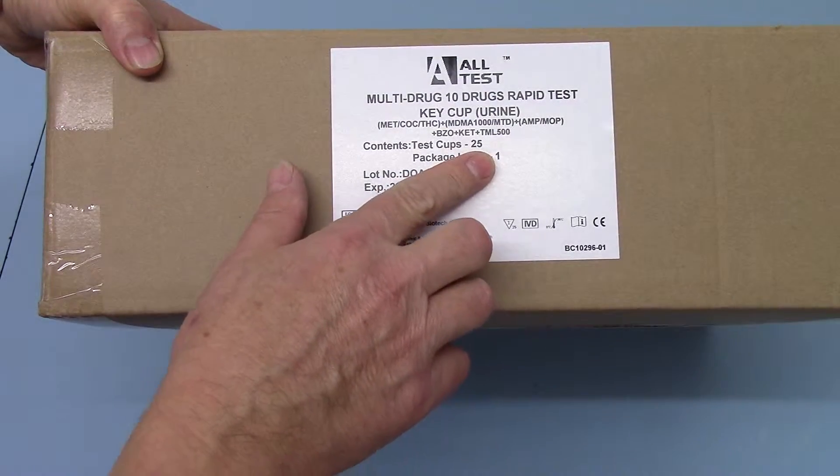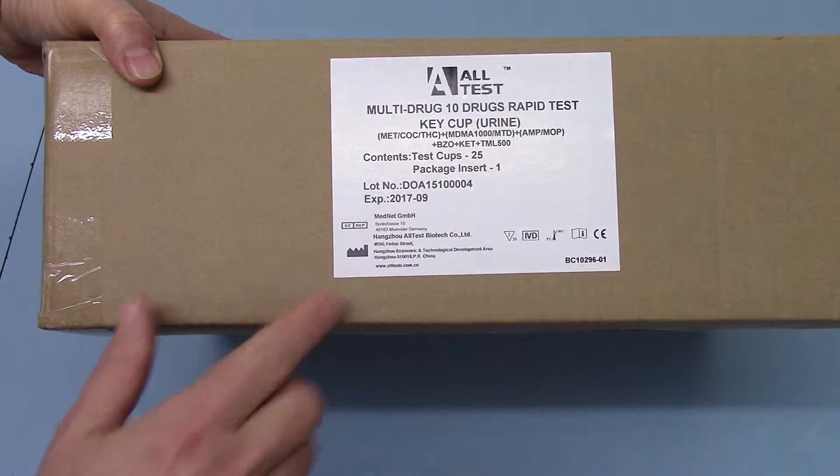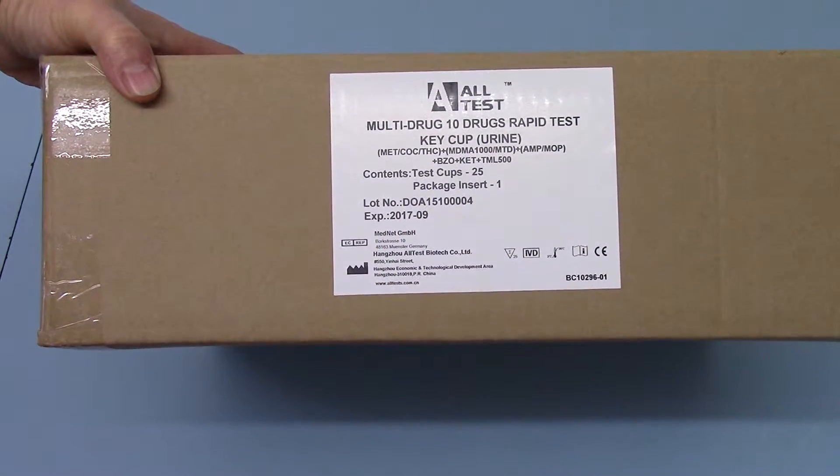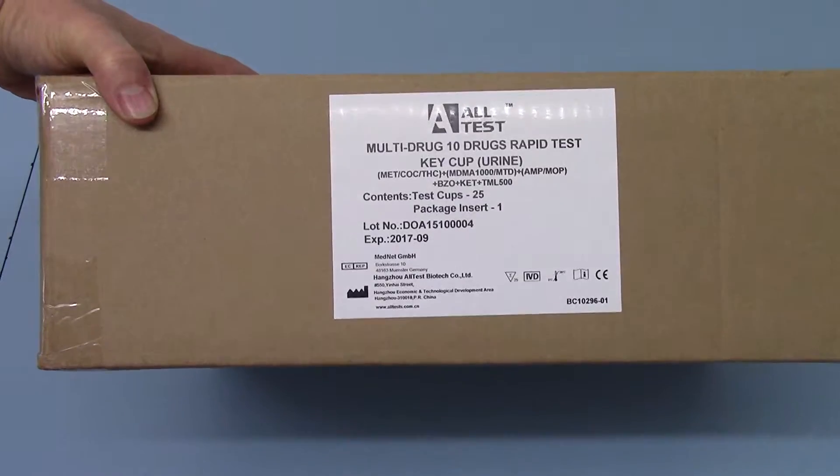Contents here is 25 test cups and a pack insert. On the outer you'll get the expiry date and the lot number shown, and the manufacturer's in vitro diagnostic standard labelling.